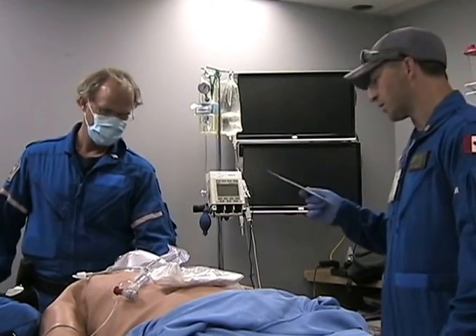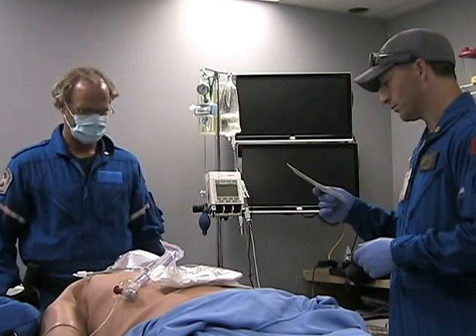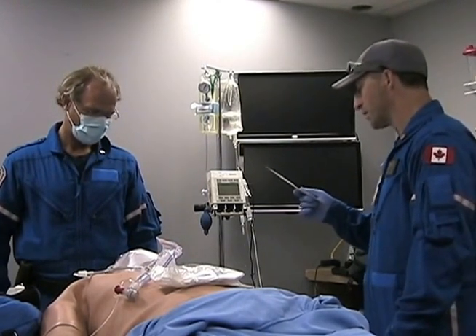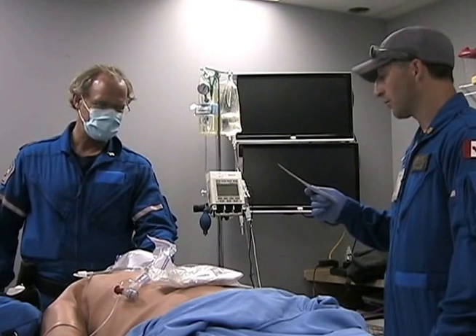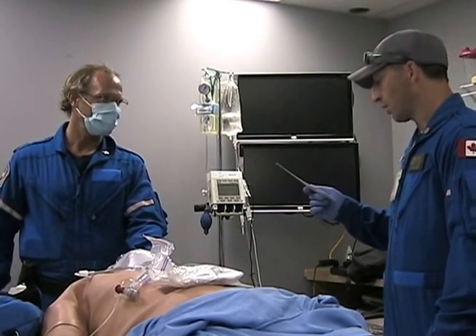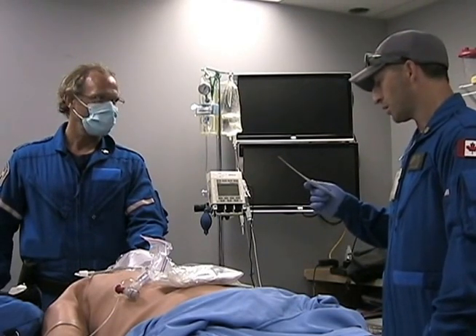Sources of difficulty discussed. So he is a predicted easy airway, and there are no physiologic predictors. Assistant one brief regarding ELM, suction, bougie, removal. Okay, so you're going to be assistant one, helping with ELM when we go to intubate. If I leave the stylet in, you'll pull that out, otherwise you'll be assisting me with the bougie. Okay, assistant two brief, spinal motion restriction, collar open. We don't need that because it's not indicated.